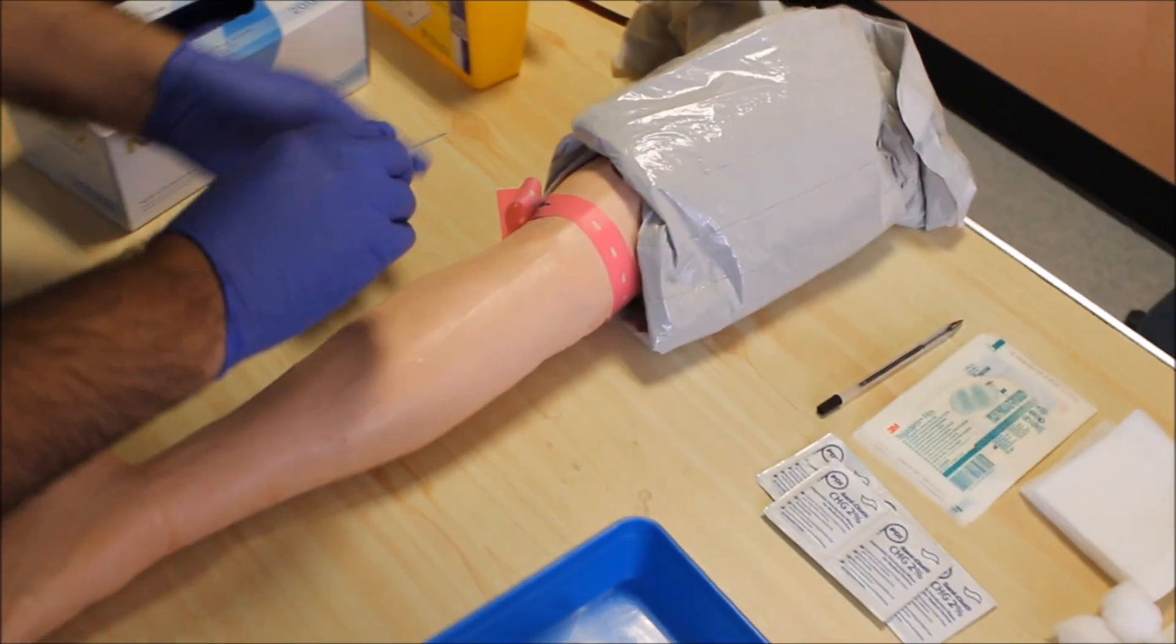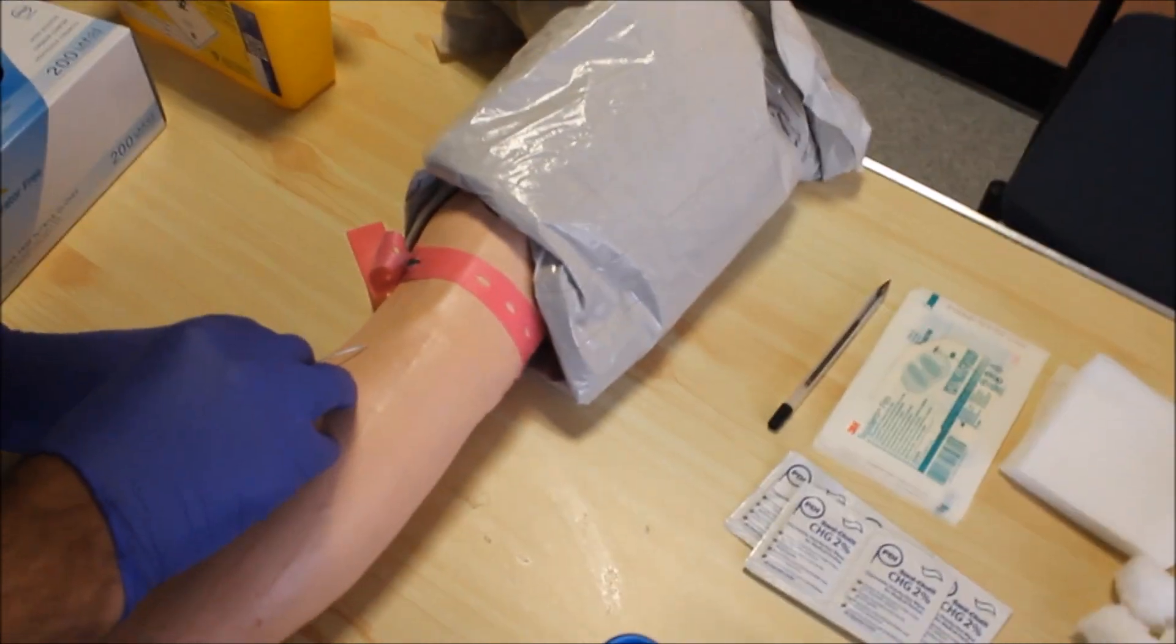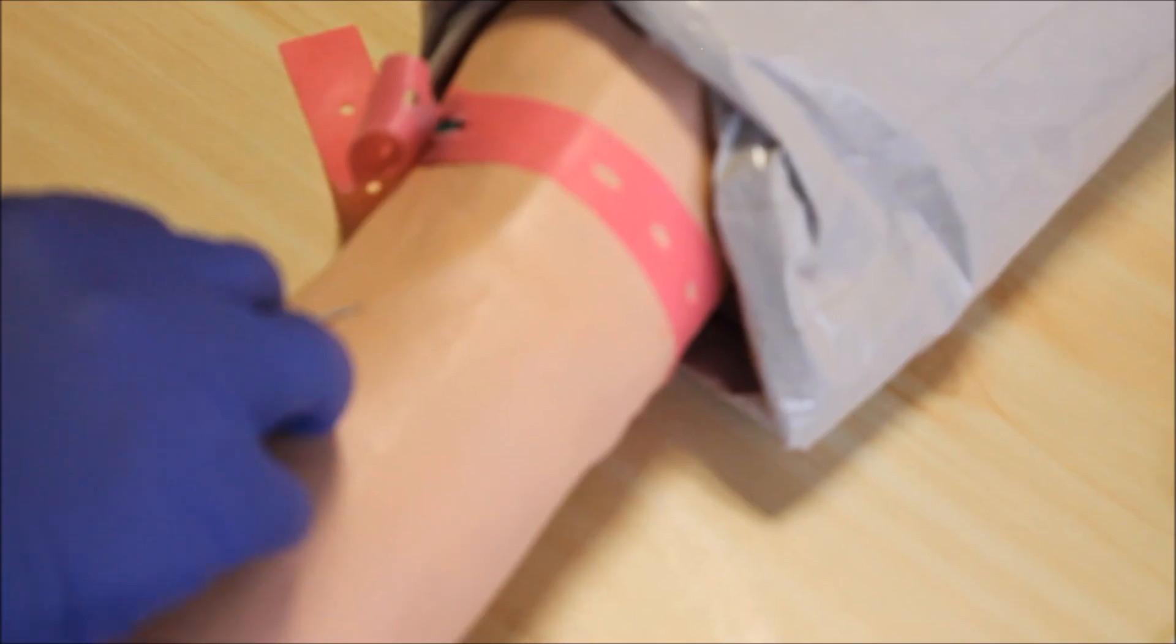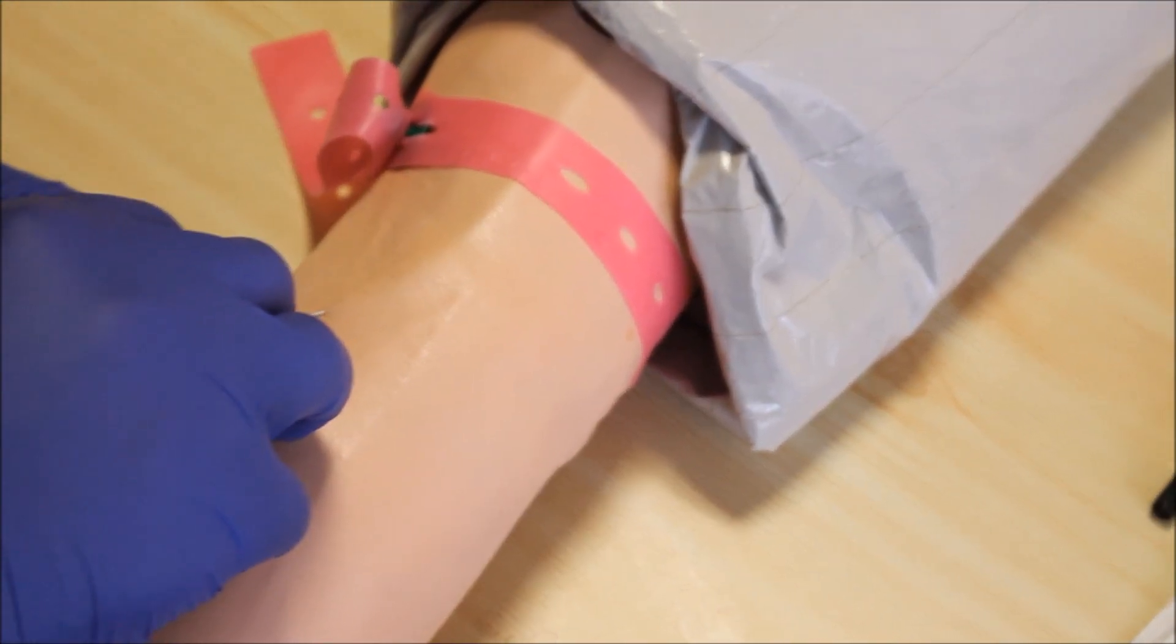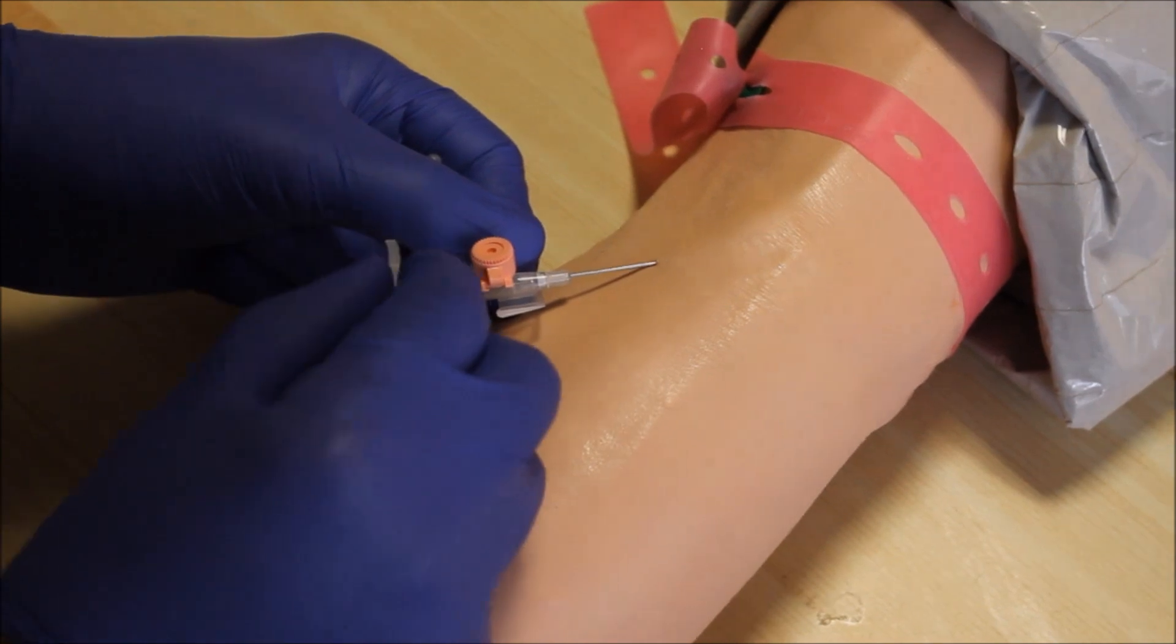Take the cannula and let the patient know of a sharp scratch before you go in. Sharp scratch. You will see a flashback over here and that will show that the cannula is in.